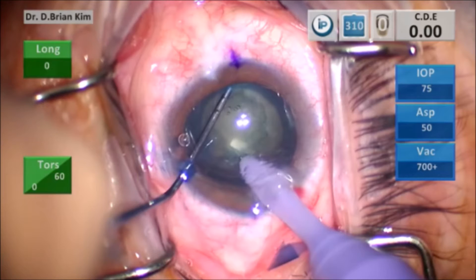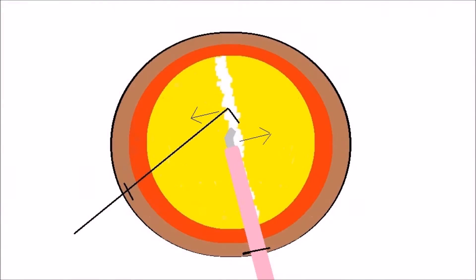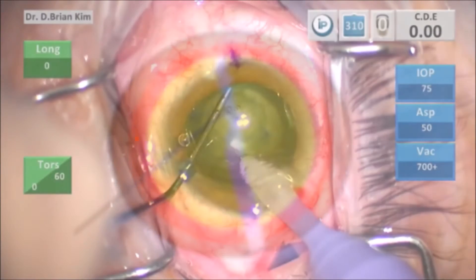the phaco tip. And that again shows that mechanical forces are being used to fracture that lens. And after I fracture the lens, you'll apply lateral separation to divide the lens.